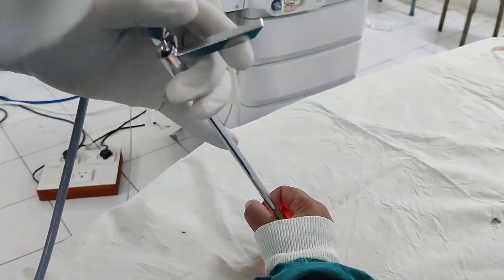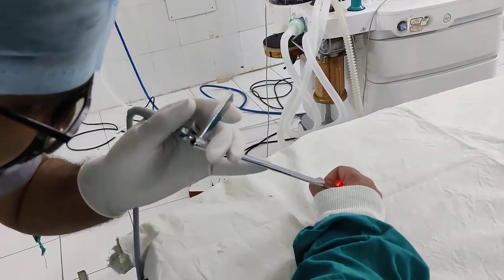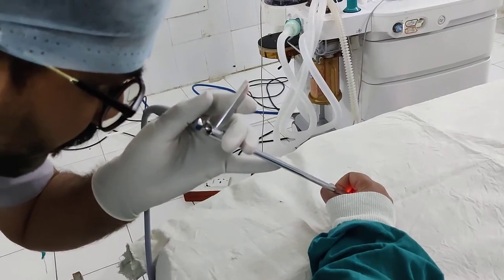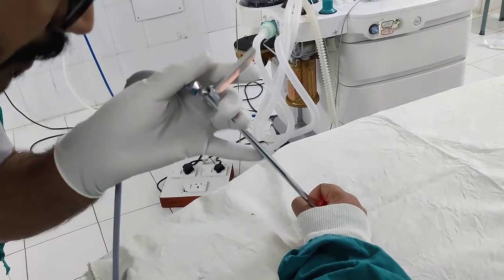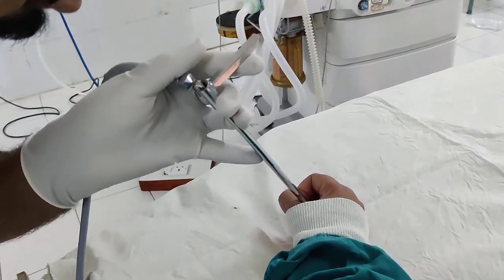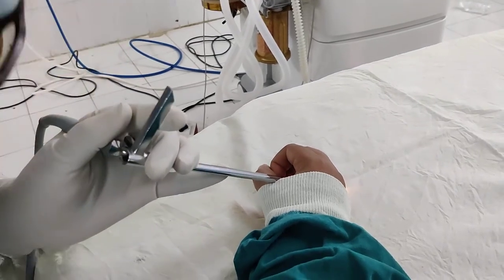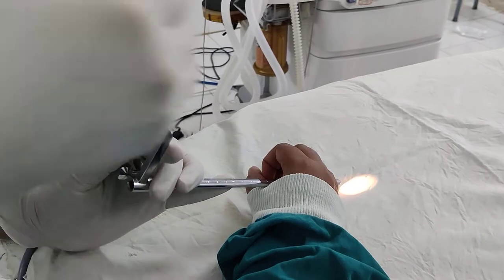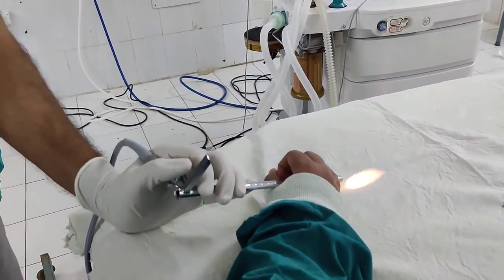Once you go into the esophagus, you have to adjust your position accordingly — to this side or that side. You should be very careful not to damage any mucosa inside and you should examine slowly, dipping inside gradually, going till the level of your esophagus. This is how you have to proceed to the level of the esophagus, not damaging any of the structures.